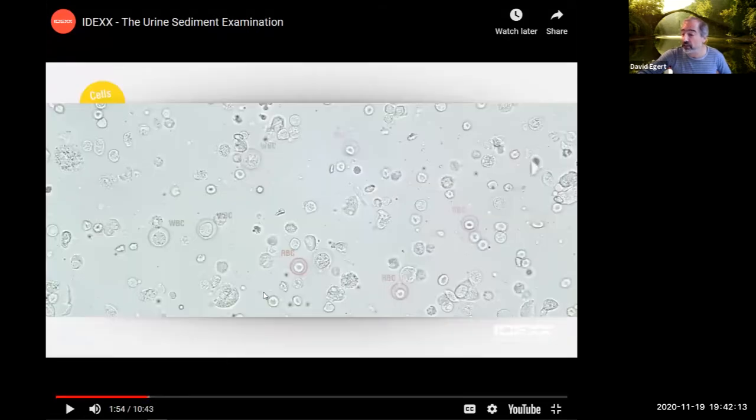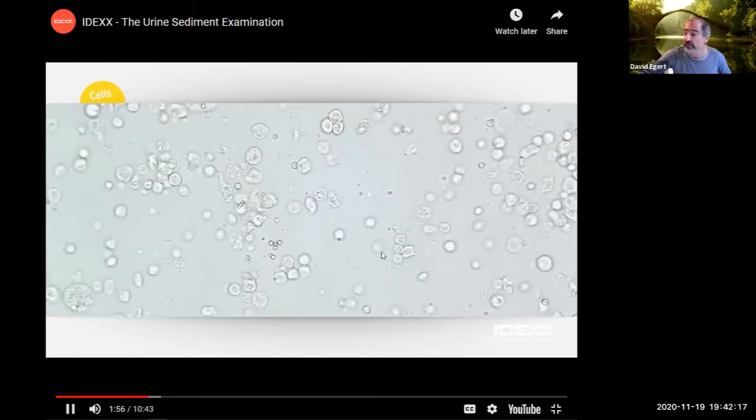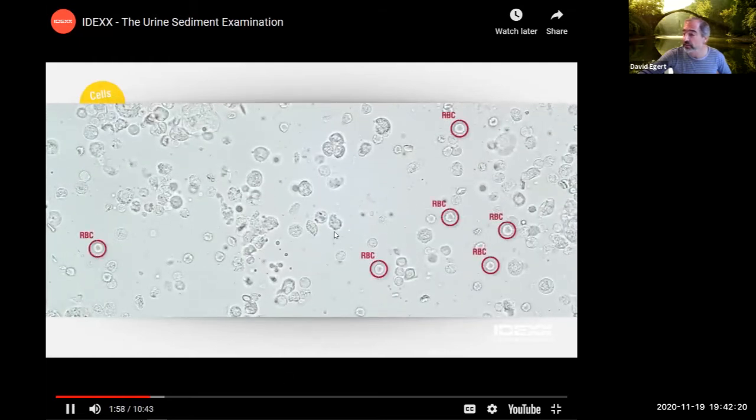He's a veterinarian, but he's talking about just some of the stuff you find in urinalysis, in the sediment analysis. It indicates the presence of inflammation, which could be infectious or non-infectious. And right, so watch it. It's 10 minutes. Watch it.